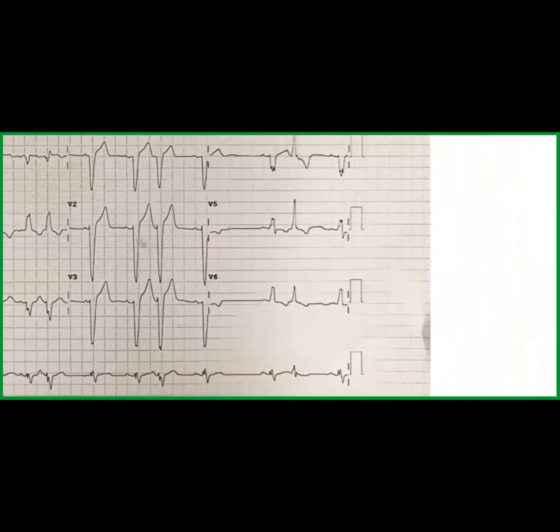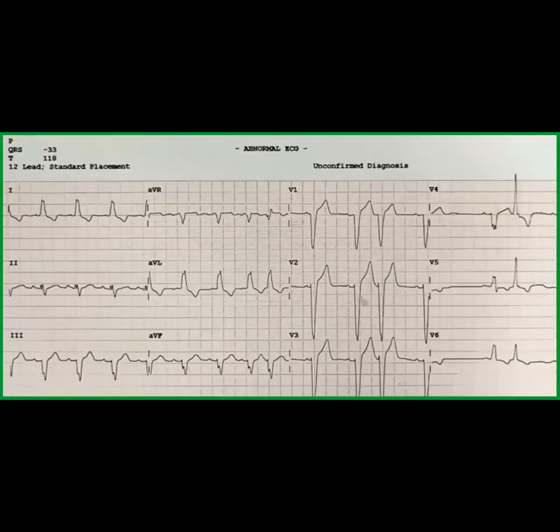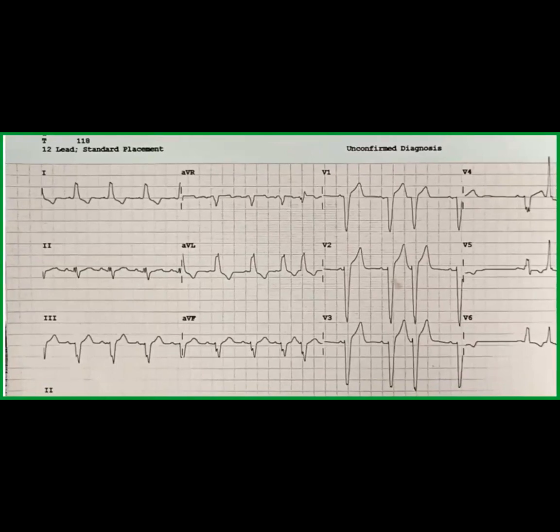The positive narrow deflection after V5 is a premature ventricular complex, which is a topic for another day, really. But we are able to see that the QRS complex before that appears quite notched at the top. That's a monophasic R wave, as we put it. So putting all of this criteria together, we are getting closer to diagnosing this patient with left bundle branch block.